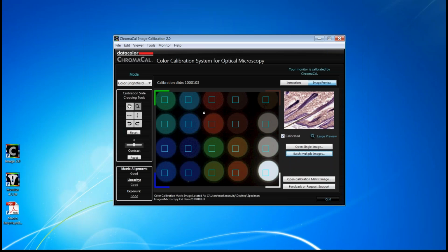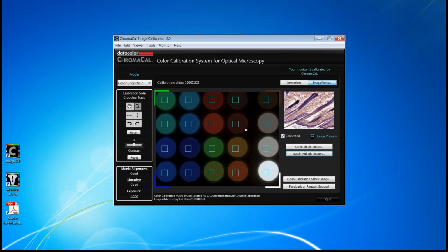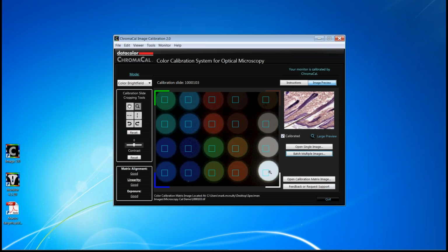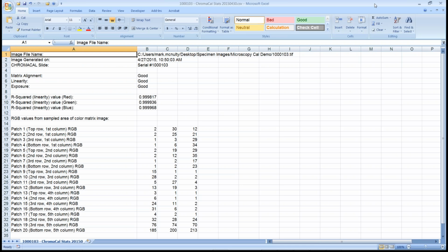So let me end with just a couple more comments. We talked about linearity before and the ability to hyperlink to that plot and look at the red, green, and blue channels. We've also added a feature under the tools menu that allows you to track the underlying statistics in this calibration slide image. And this came up by a request from a user of a whole slide imaging system who said that those black boxes, he's often concerned that he can't monitor the compliance or the drift in those systems over time. So this allows him to capture calibration slide images over time and then do a comparison. So it's as simple as just clicking that calibration slide tool. It'll then save that into an Excel or spreadsheet format. And you can then bring up that spreadsheet and quickly look at the underlying statistics on all that calibration image. And what you would do over time is simply compare these numbers to an image taken at a different period of time.